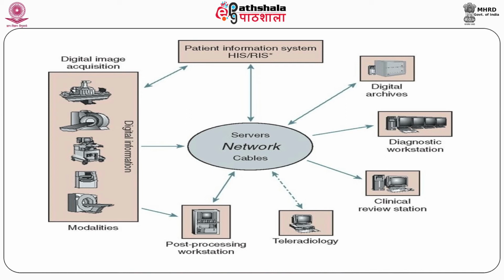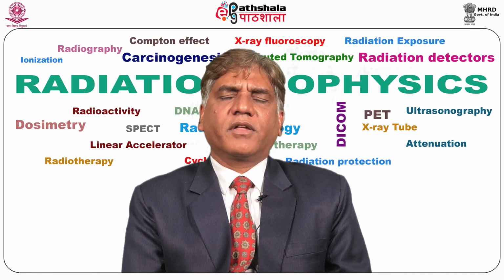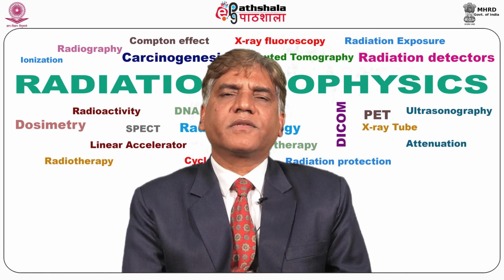The image can be transmitted to individuals in the department, outside the department, outside in the world through Ethernet. So that is the advantage of PACS. PACS are an integral part of the radiology department. We usually have, in the radiology department, a mini PACS.